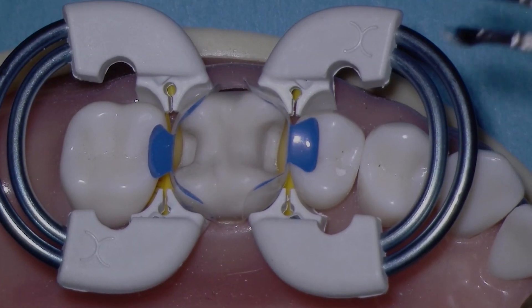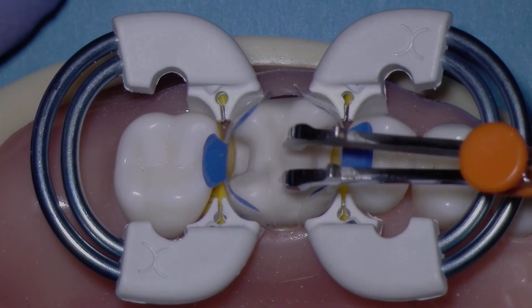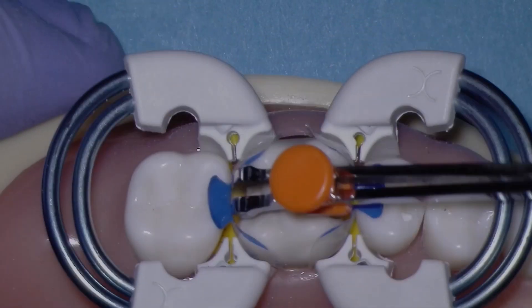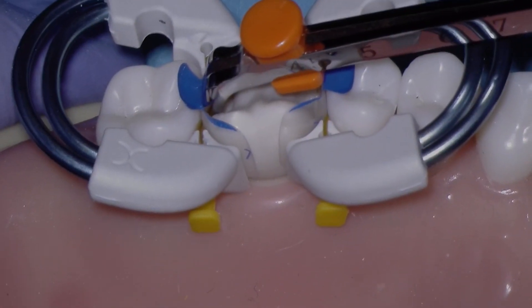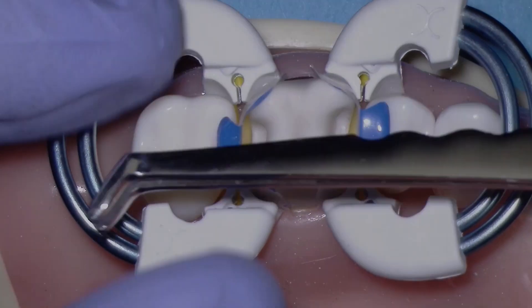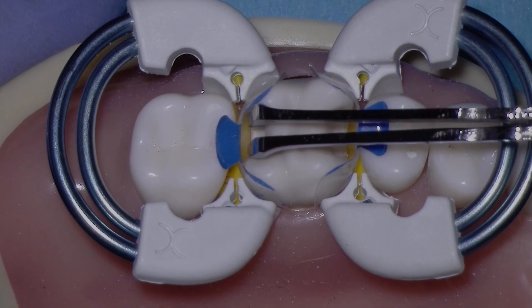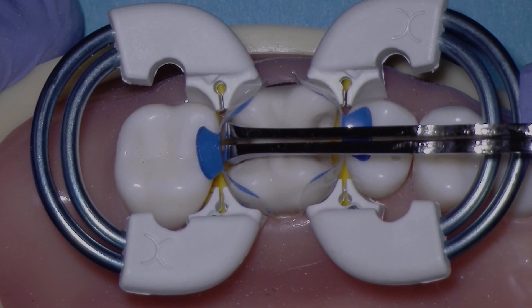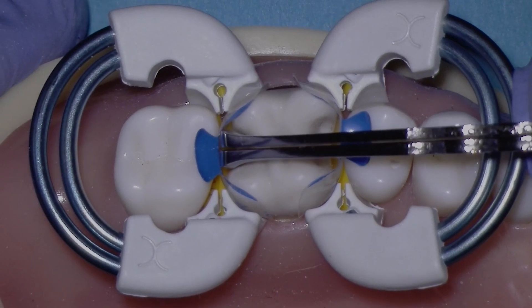Now, let's look at a small cavity preparation. Even though I would have the setting at about 4.5, it's barely fitting into the small cavity preparation. This would work, but if it was any smaller, we would need to use the small, non-adjustable end of the instrument, which easily adapts to small cavity preparations.